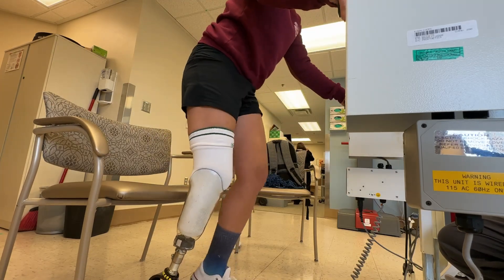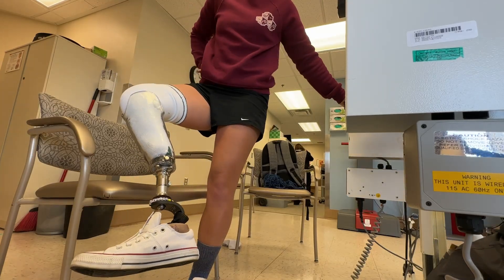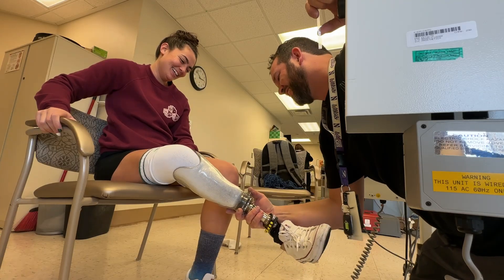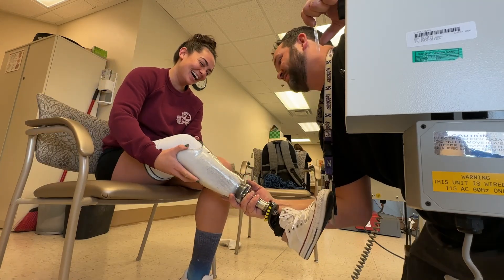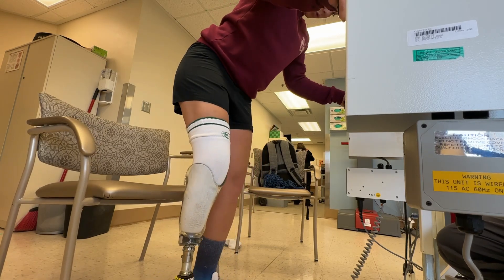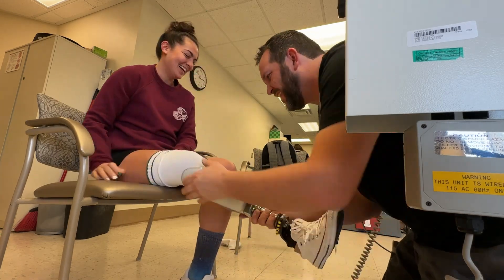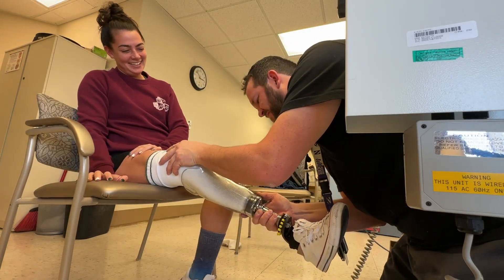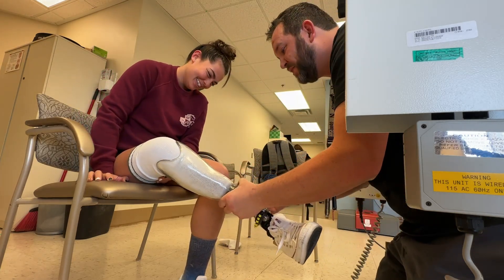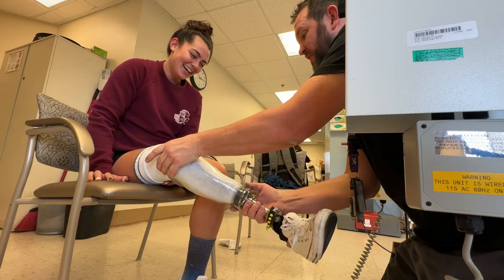Oh, that was tight. Oh! What was that? Oh! Okay, go ahead and take a seat. We're not standing in the audience. You okay? Yeah. Oh, that was tight! What was that? And now it's locked up. Wow. I don't know what I did. That's new. That's not you. If it broke down, it's good that it broke down, because we don't want to send you on something that's going to break.